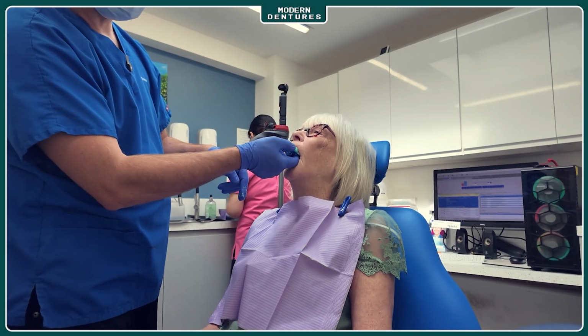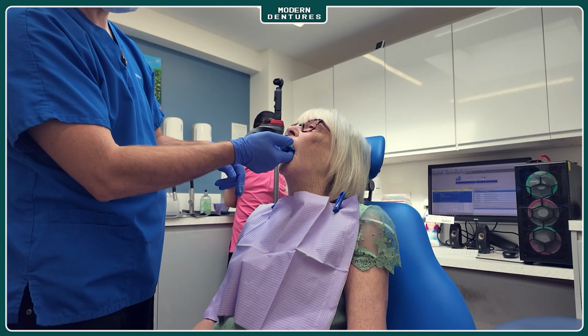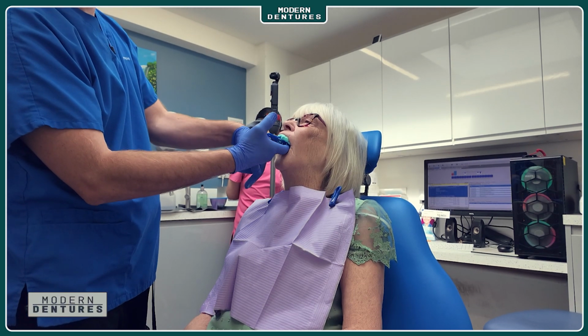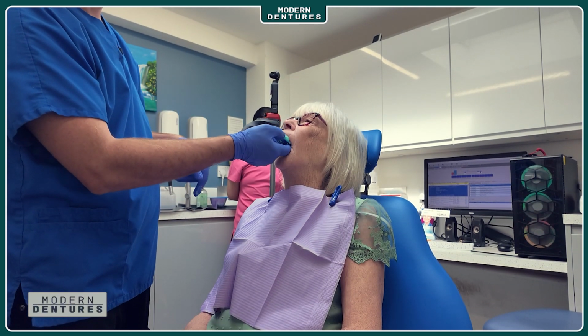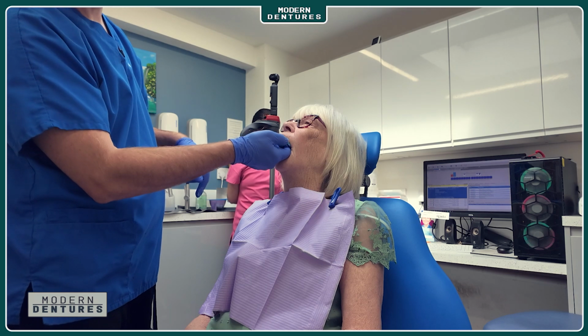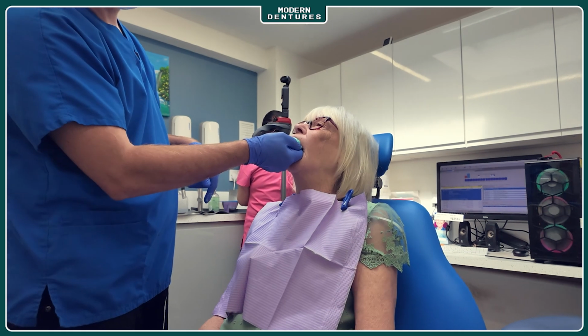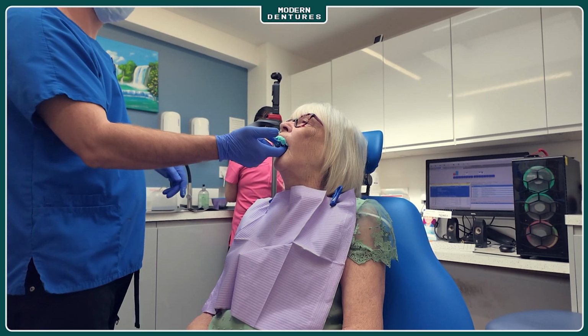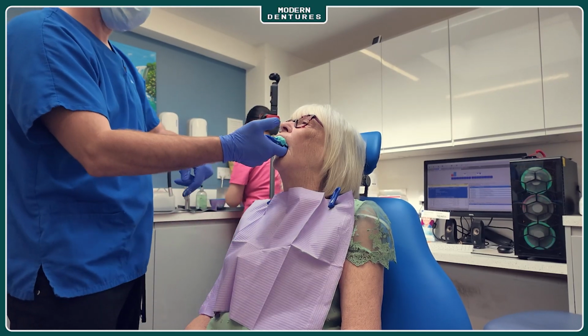And I've got quite a bit come out the front, so I can just check whether it's set there rather than on my hand. We don't always get that, so that's why I always put a little bit in my hand. It's just starting to set now, so it doesn't take too long. It's very warm today, so we've mixed the alginate with cold water, but if it's a cold wintry day, sometimes we'd mix it with slightly warmer water just to activate it and make it set a little bit quicker. Or we do that if we know that the patient's got a gag reflex and we want it to set super quick.